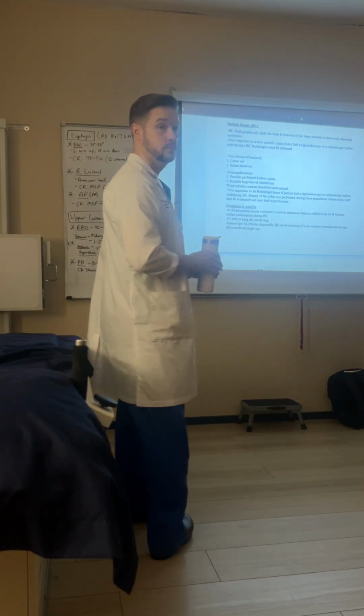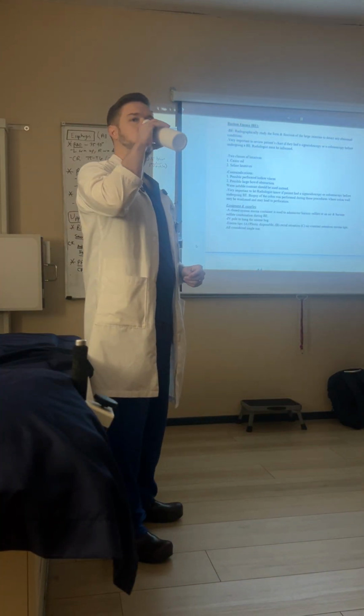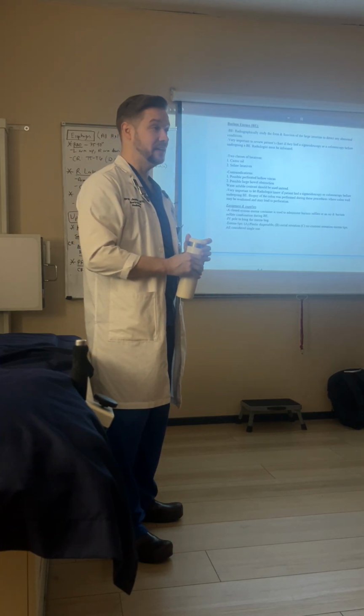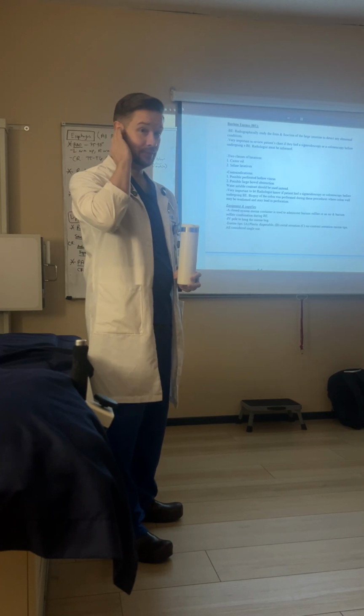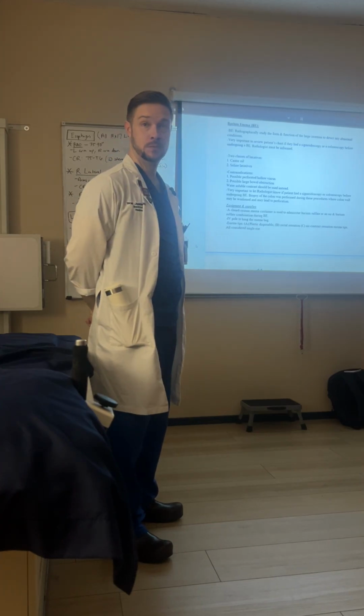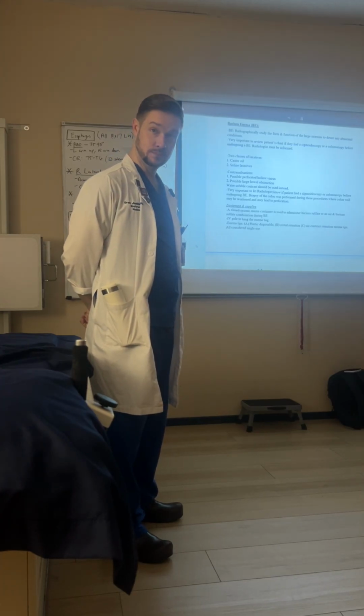We do not just do fluoro on our own without a doctor, a radiologist. Unless you're scanning the lead. In California, it is illegal.